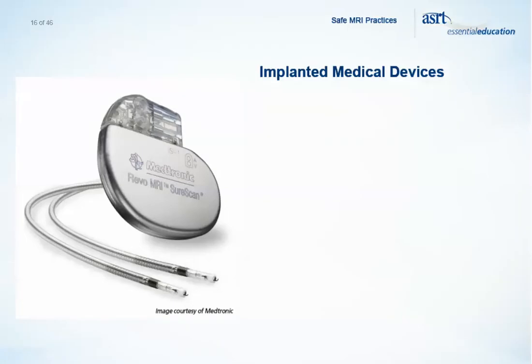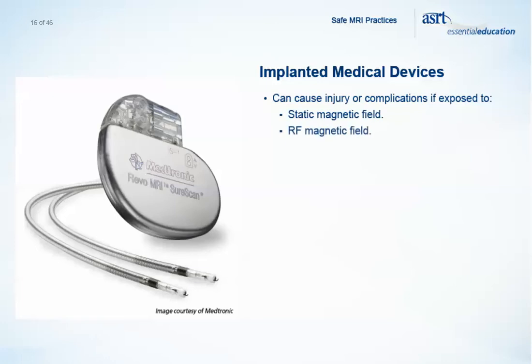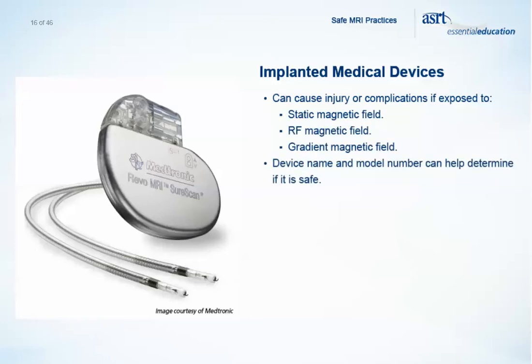Implanted medical devices can cause permanent injury or serious complications if the patient is exposed to the static, RF, or gradient magnetic field. Knowing the device name and model number can help staff determine if the device is safe for the facility's magnet strength.